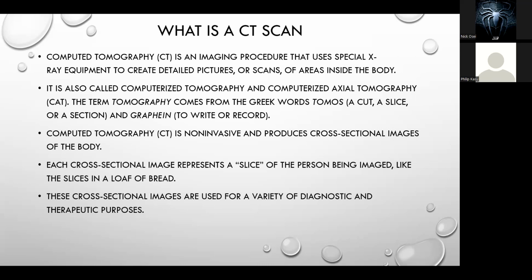It's also called computerized tomography. Sometimes it's called computerized axial tomography, where you hear the word CAT. And the word tomography comes from a Greek word tomos, that means a cut or slice. That is because the CT scan cuts the body into various slices and shows you how the picture looks, various slices of various aspects of the body. And graphy means write. So tomography, cut or slice write, if you want to interpret it literally.